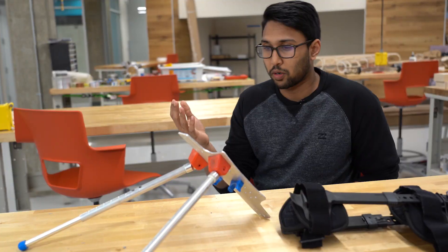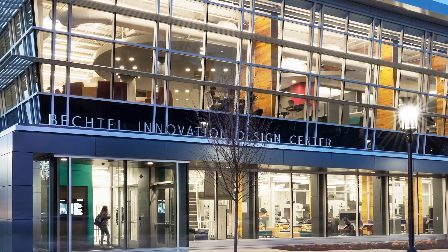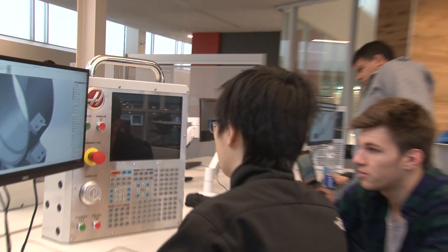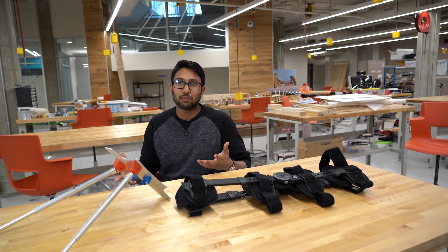Most of the prototyping actually occurred here in Purdue's makerspace, the Bechtel Innovation Design Center — very high-tech machines, a manufacturing shop on the first floor, and a 3D printing lab on the second floor, for any student of any major to come in and work on a passion project.